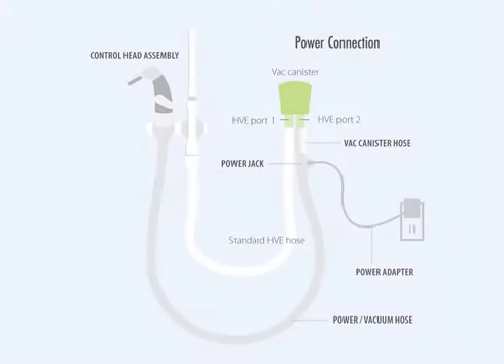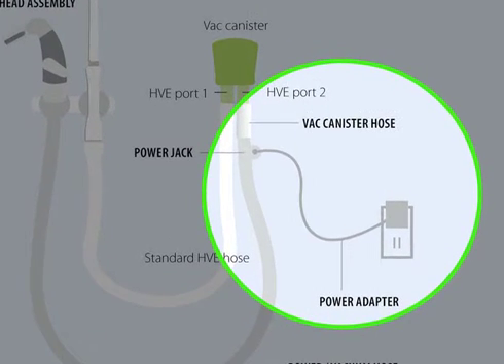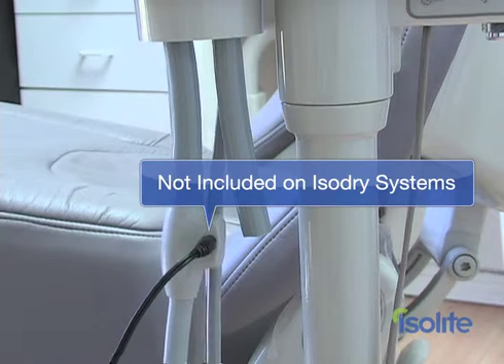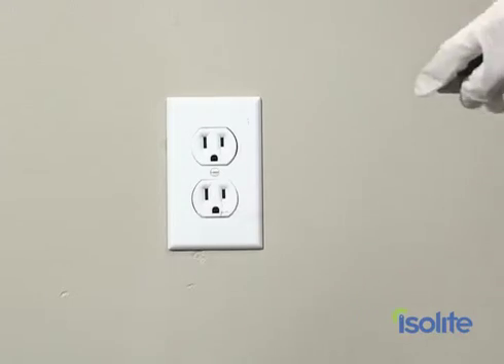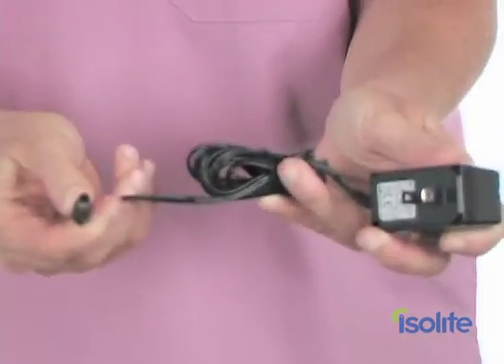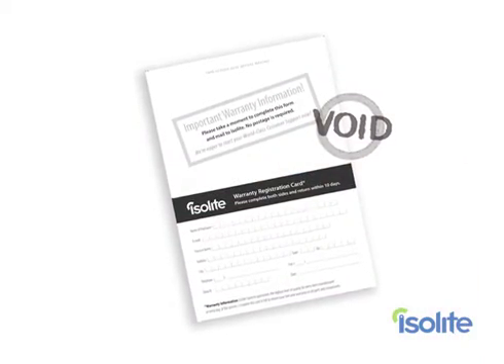If you purchased the Isolite Dryfield Illuminator, you will need to power it up so that the five levels of internal illumination get the energy it needs. If you are installing the Isodry that does not have the internal lighting, you will skip this step. Just plug the adapter into the Isolite power jack, then plug the power cord into a standard electrical outlet. A green indicator light will light up once every 10 seconds to indicate that the unit is powered up. Make sure that you only use the Isolite adapter, as all other adapters will permanently damage your Isolite and void your warranty.